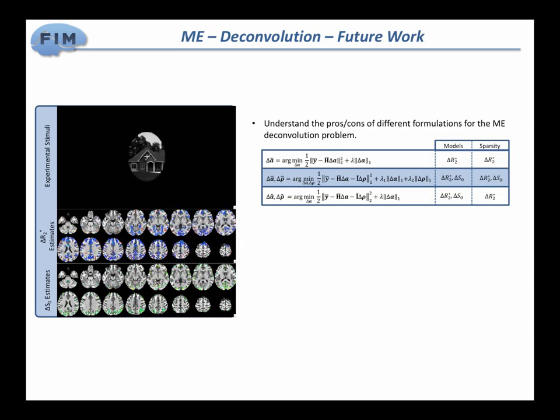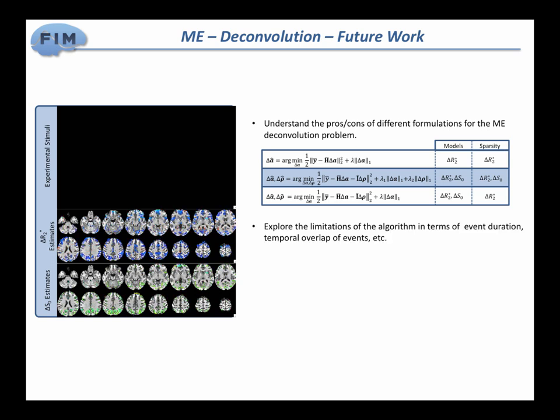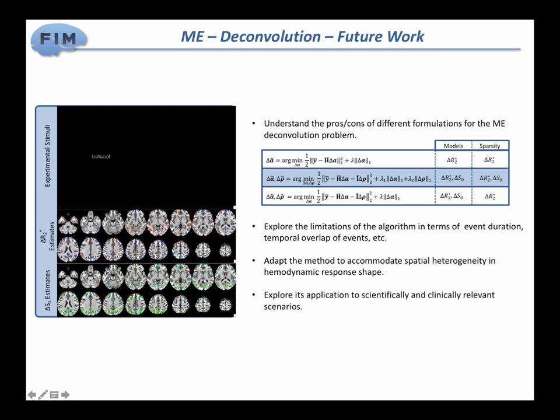So this is some work that is in progress. We'll have a publication in the making and a couple of things in proceedings, but there are a lot of things that we're still evaluating. There are different models. As I say, you can think of having different assumptions about the sparsity, or you can do MICA first and then say, well, mostly I have taken care of all my delta S0 things, so I'm just going to model just the delta R2.